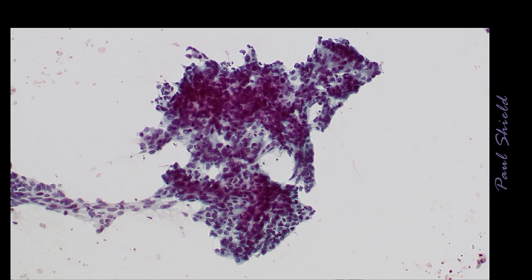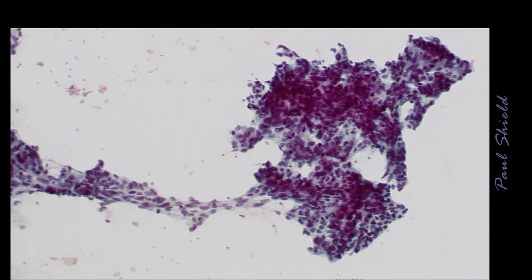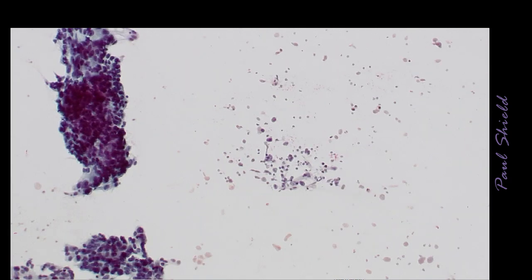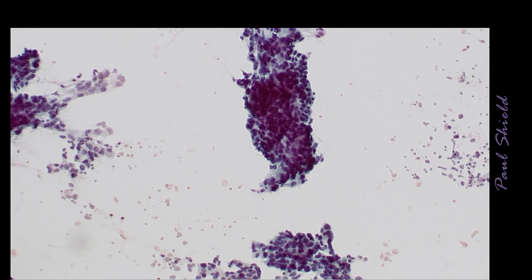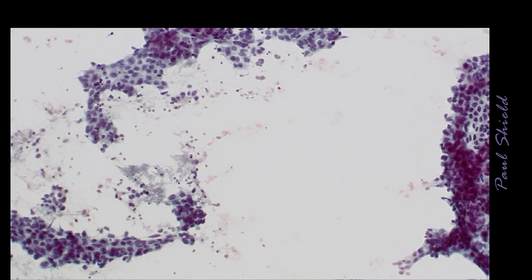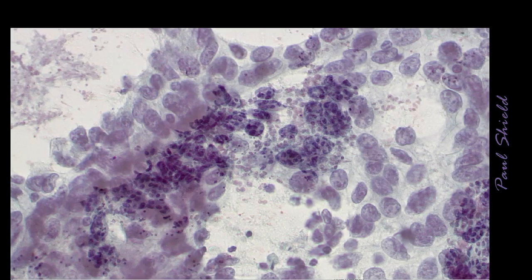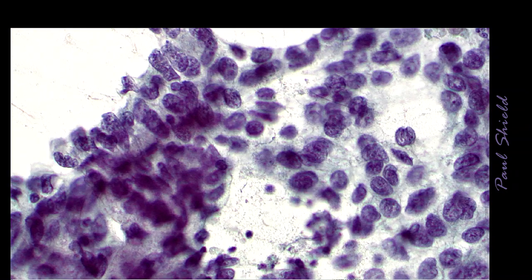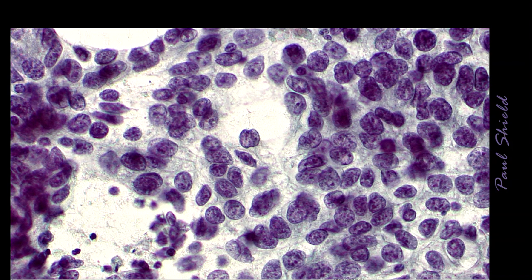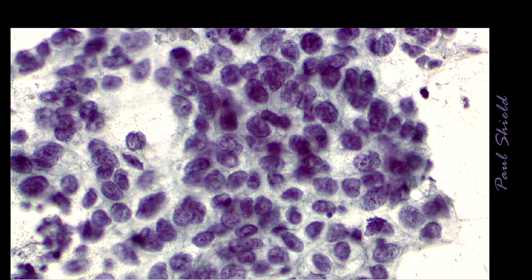This is perhaps an easier group. It's less differentiated. So we've got here clusters of obvious carcinoma. We can tell that it is very hyperchromatic and abnormal, and there I've got like a crowded sheet of cells, and here you can see it's that very disorganized arrangement of adenocarcinoma. The cells are basically in like a crowded sheet.